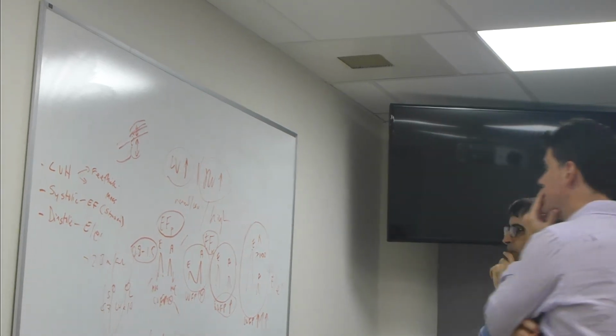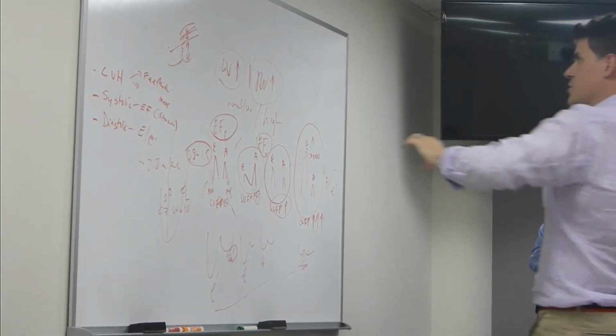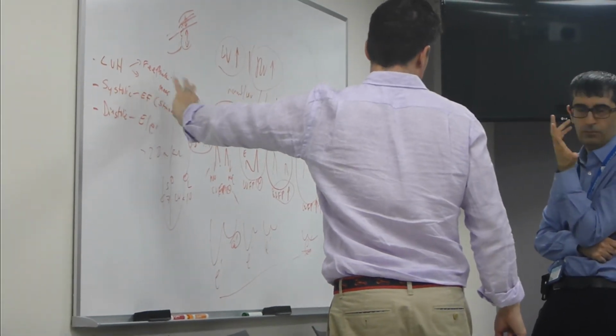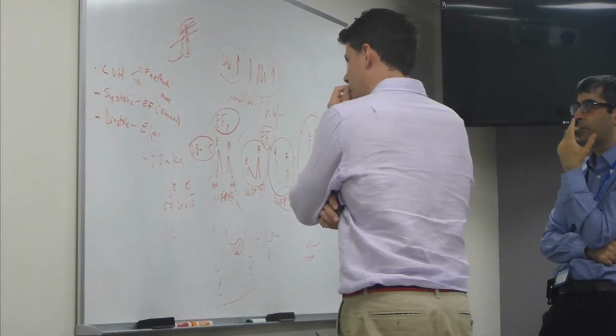So maybe in terms of practicality, what we could focus on in the hands-on session is just measuring wall thickness. I think that's probably going to be easier than looking at mass, and we don't have to worry about how tall people are, et cetera. Right, mass is complicated. Yeah, I think you can just do thickness.